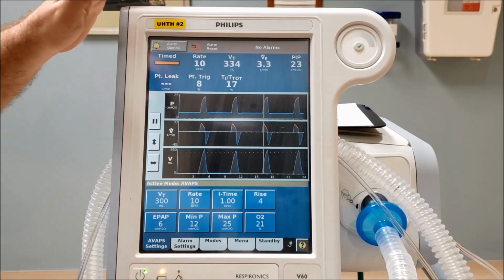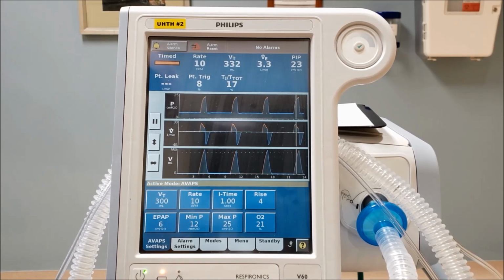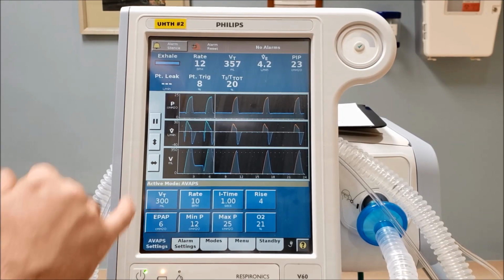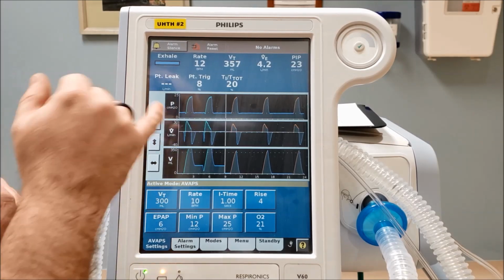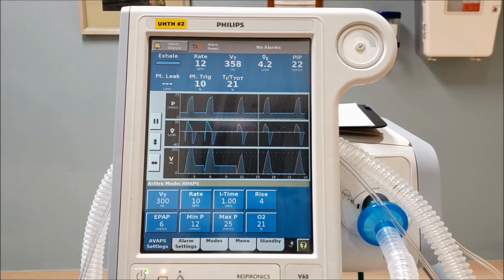These are all machine delivered breaths. Okay, patient is not triggering these at all. If the patient would trigger, I'll show you what would happen with that. There you go. We kind of got that turquoise looking color there. And you can see the initial flow drop catches up on that and then gives the volume. And then it's going to go back to giving machine breaths.